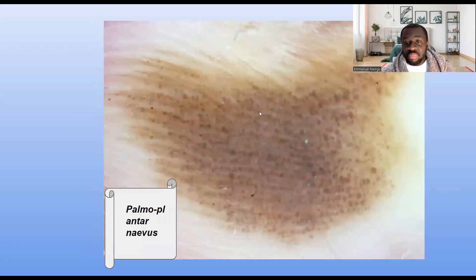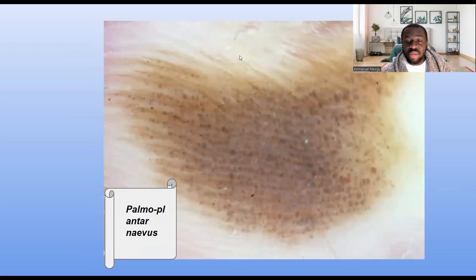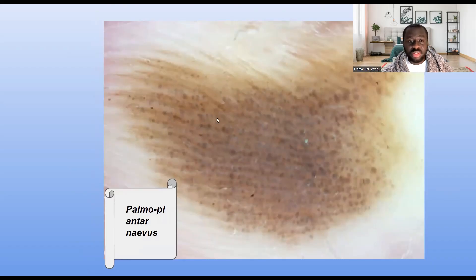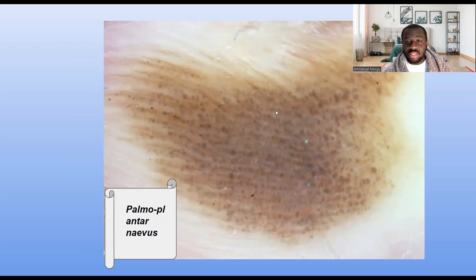This one looks like the palm of the hand or the sole of the foot — you can see those creases. Overall it looks like a regular margin, fairly homogeneous level of pigmentation, symmetrical. If I draw a line and divide it horizontally, I get relatively two equal halves. Nothing is standing out that makes me think this could be a melanoma.